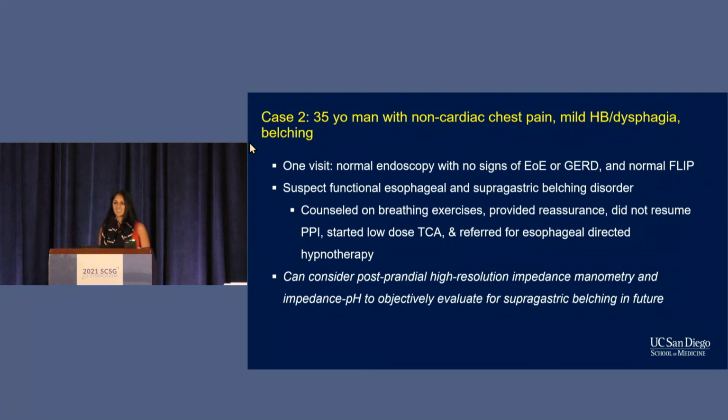And I just saw him recently. He's actually had 75% improvement of his symptoms, and he's doing remarkably well. And if he hadn't had an improvement, we could have still done postprandial manometry or pH impedance, so we still have these other tools available to us.